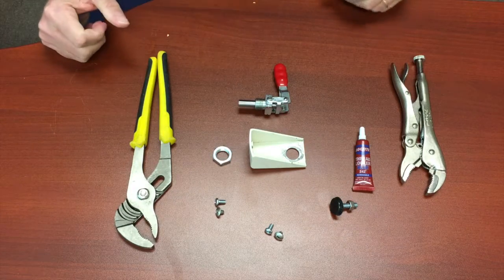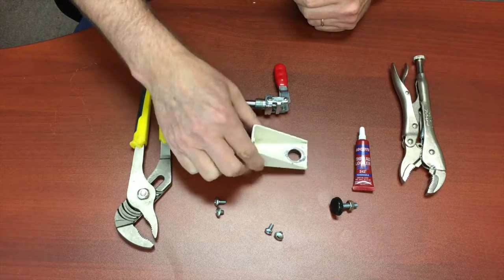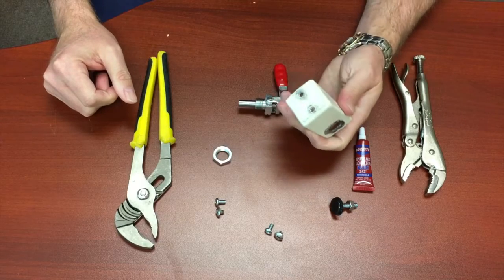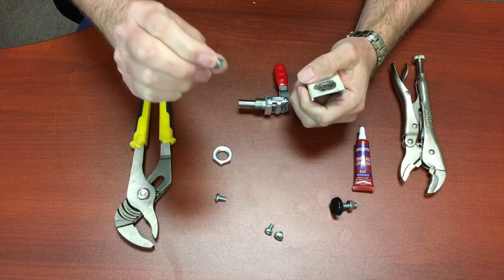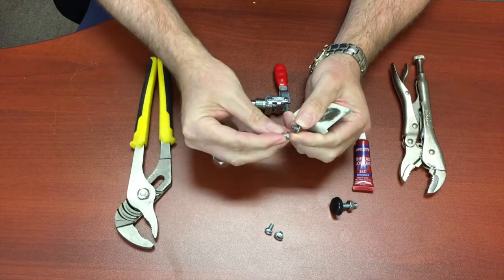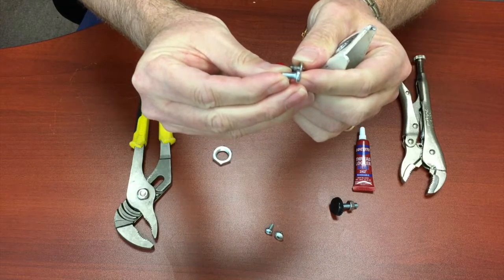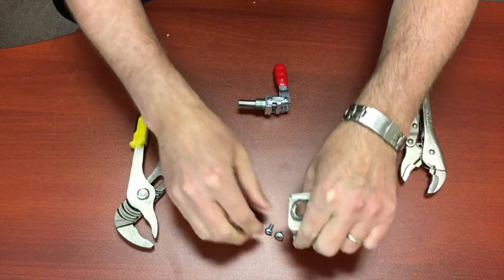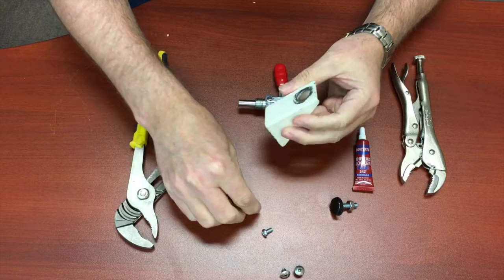to show you how to put together the brakes for the Source Ray 130. This is the housing that mounts on the machine. It's held on by two screws that go through the film bucket. The manufacturer screws are 1/4 of an inch long. I prefer to use 3/8 inch screws. They're slightly longer. And when the housing does wiggle loose, you're less likely to have it fall off and actually lose the housing and the brake if you use the longer screws.